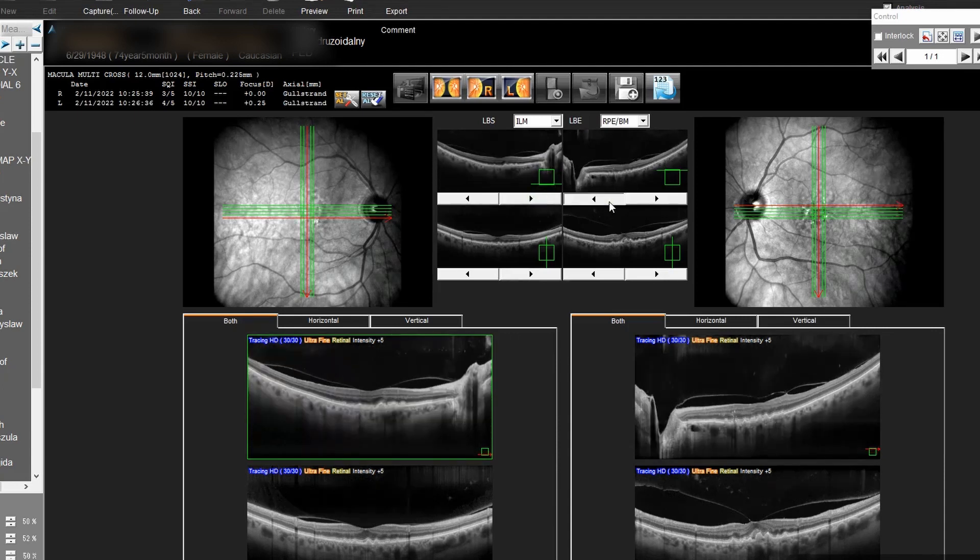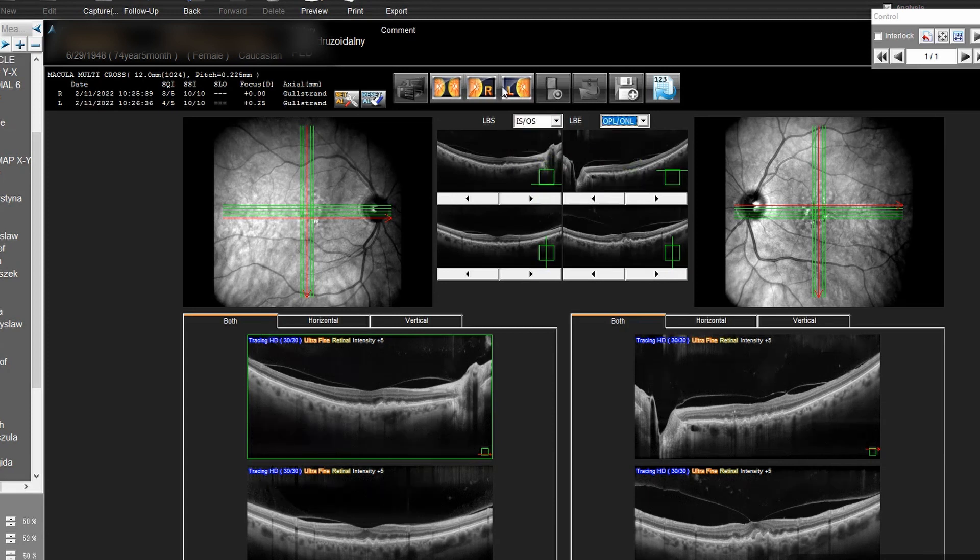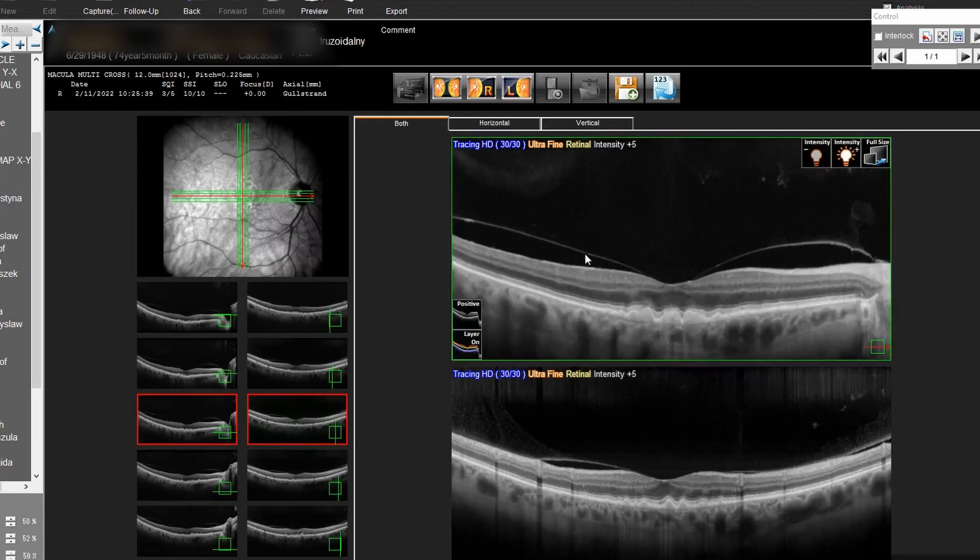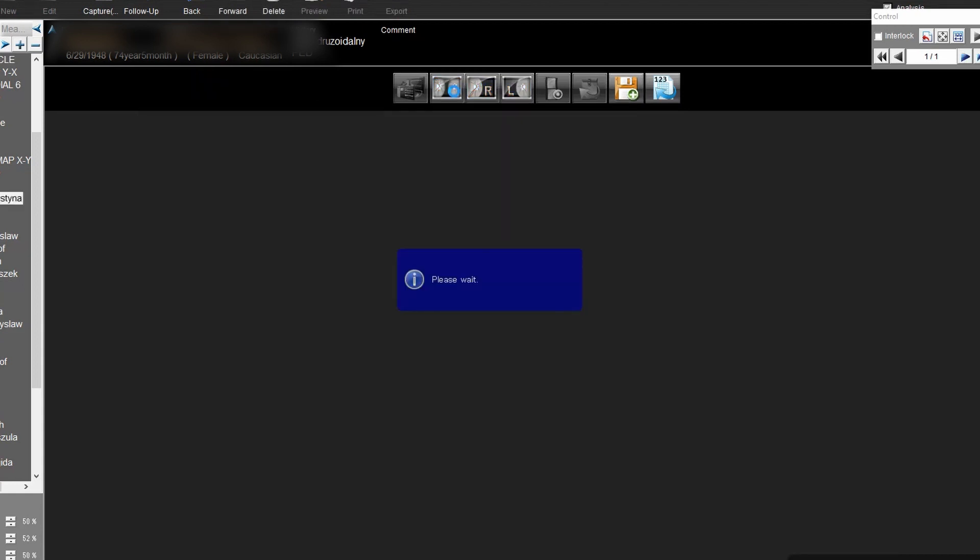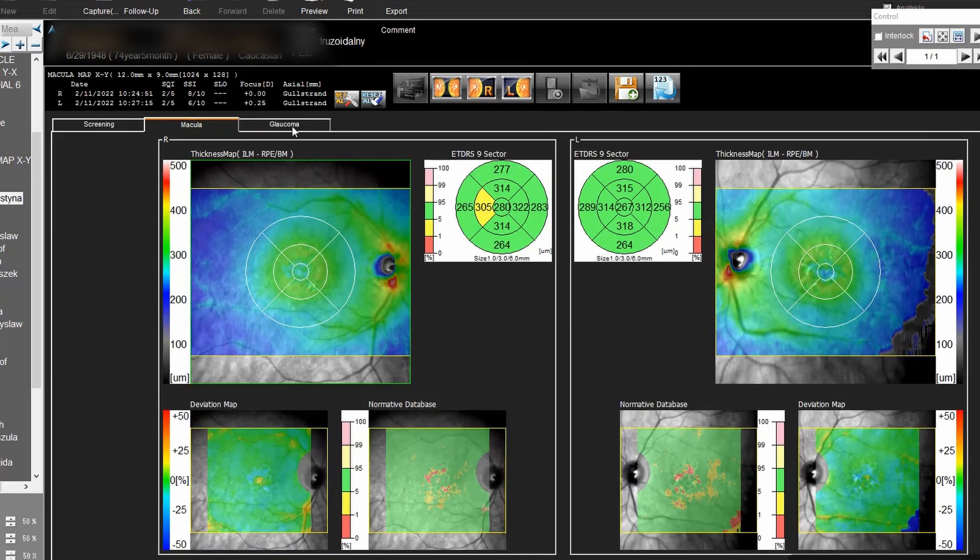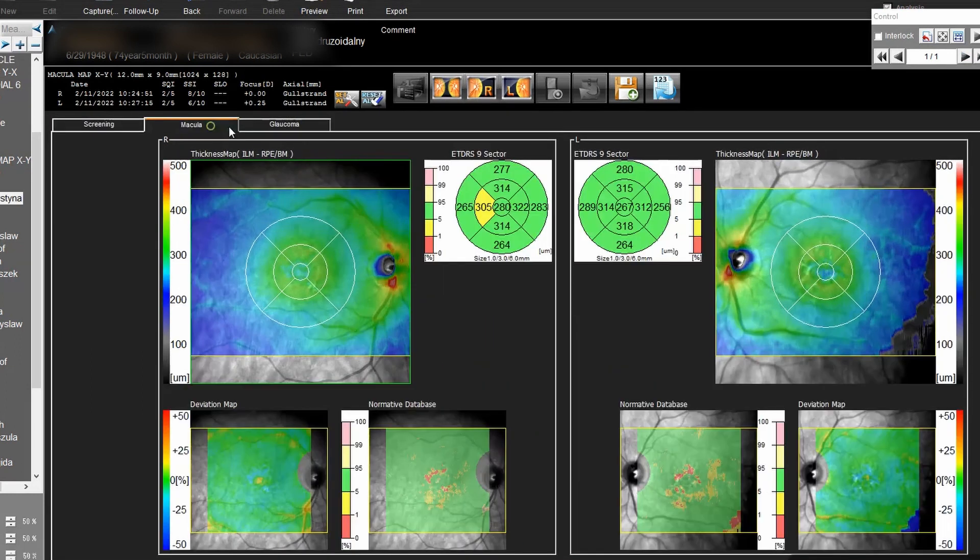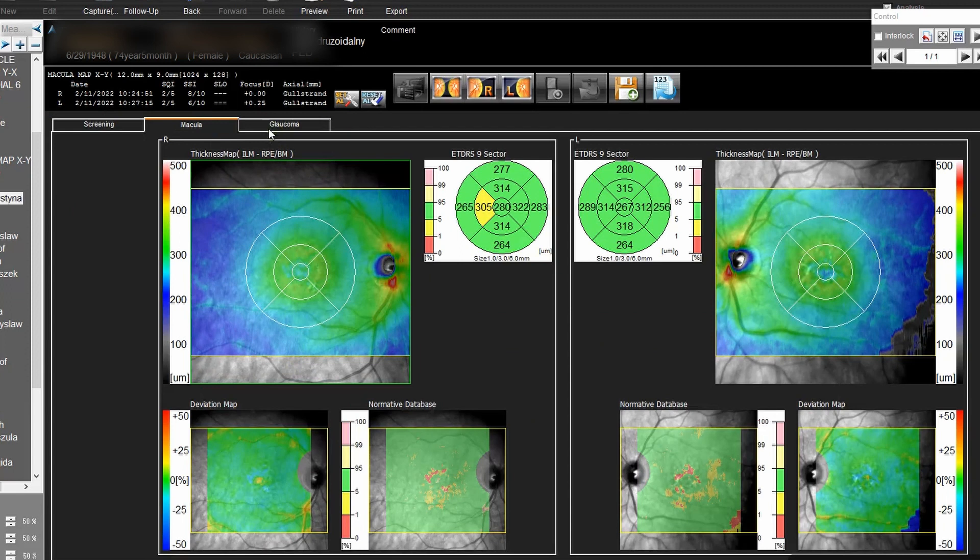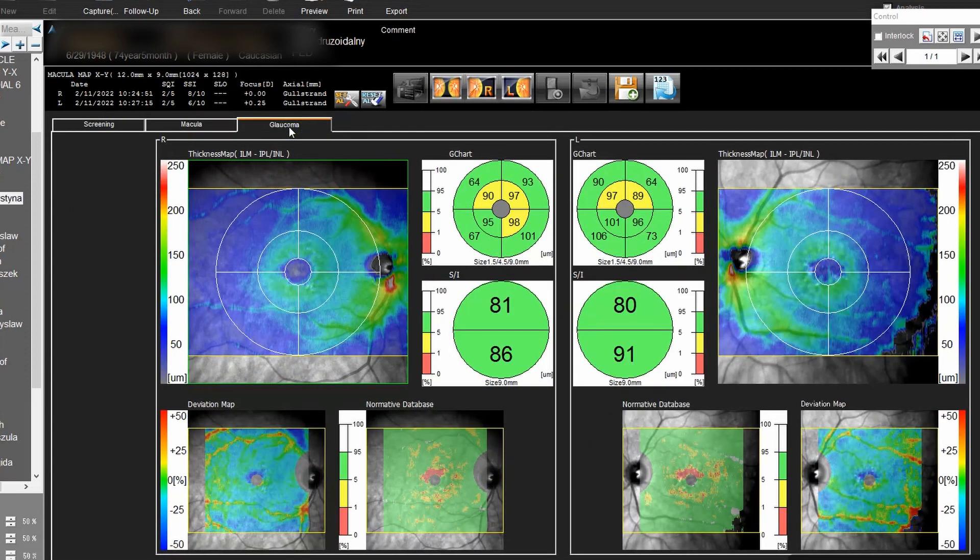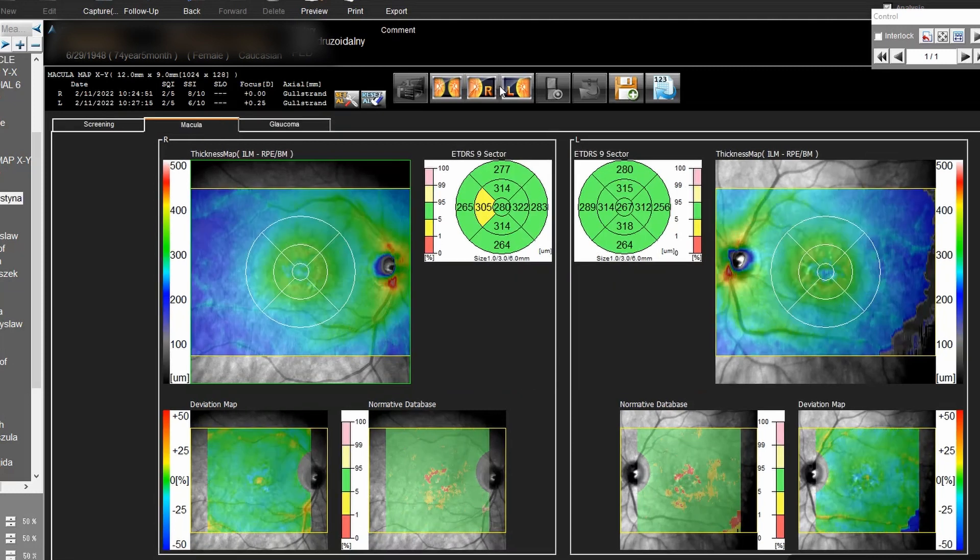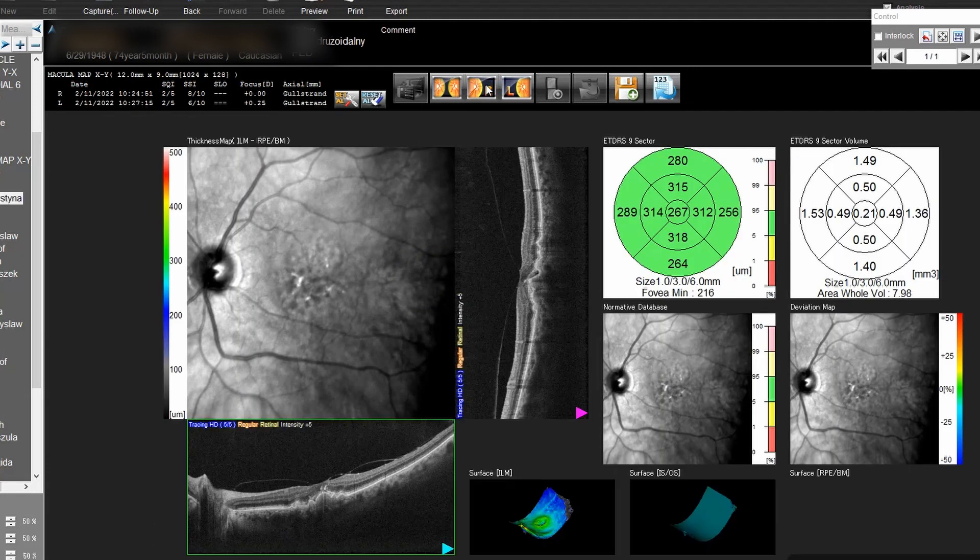If you're willing to compare between the scans or see progression naturally you can do it. Here we see two cross sections, two scans. You can switch between right and left and then see both. This is the comparison of the macula and glaucoma maps. You see all parameters on one side very easy and then also you can see progression.